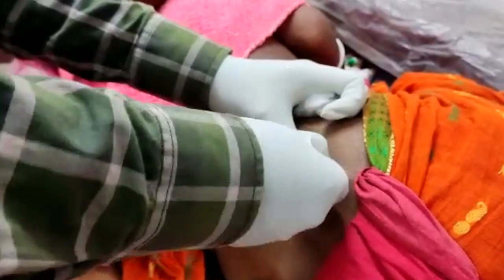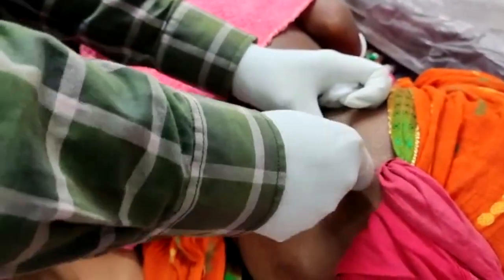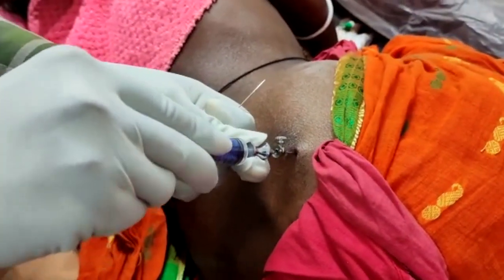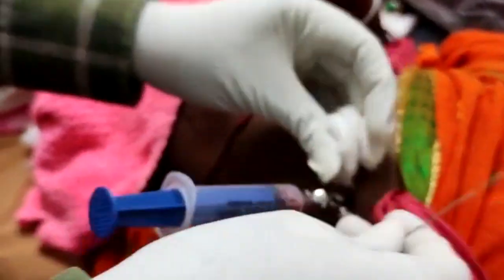After having fixed the bone marrow aspiration needle, we are now going to use a syringe. By taking out the stylet, we insert the syringe very fast and then aspirate, as you can appreciate. The bone marrow aspiration is being done and we have to take care to aspirate only the first 0.5 to 1 ml to prevent any kind of dilution.